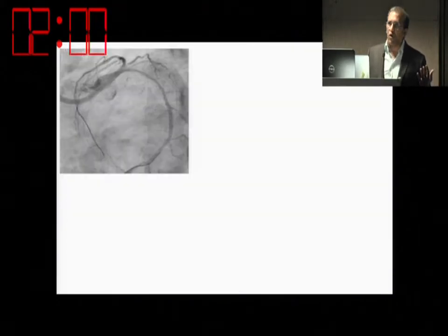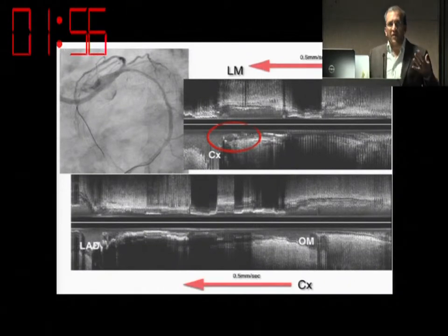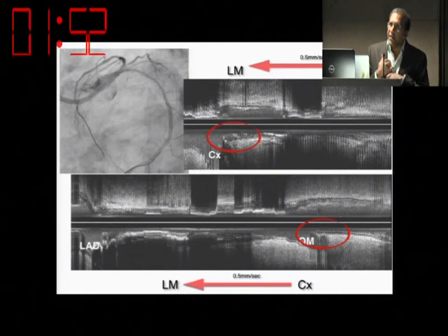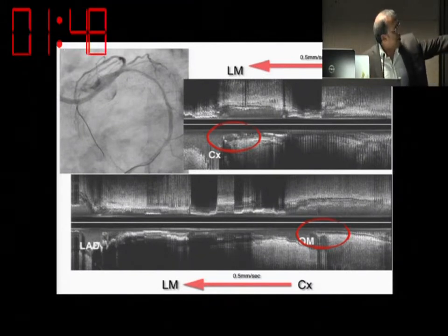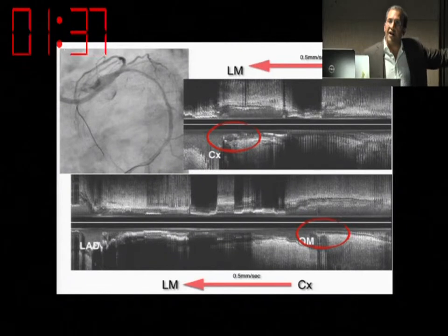I mean, this is something I've talked about in the past, but let's not go into this complex angioplasty. But when you do these calcified bifurcations, it tells you amazing information about the carina, which is in the circles. You can see the carina on the top, which is in the circumflex, tells you that the carina is free from disease in the proximal, in their distally, and in the LAD circumflex bifurcation, the carina is full of disease. So here it will have to be a bifurcation stenting.